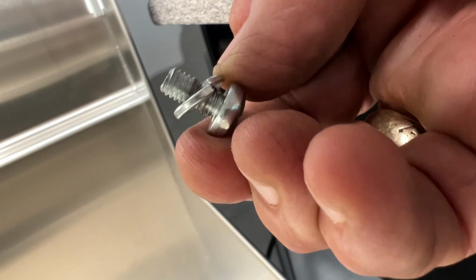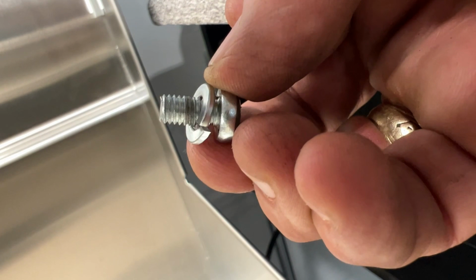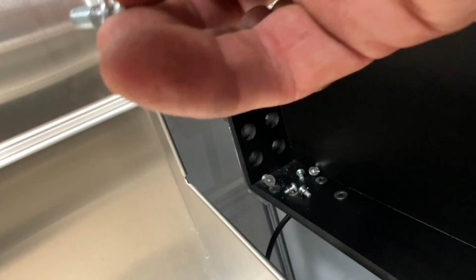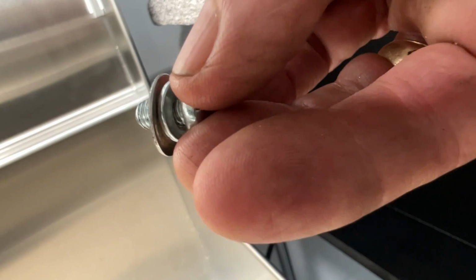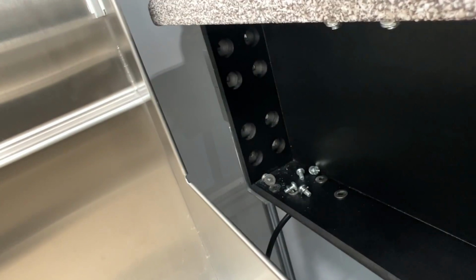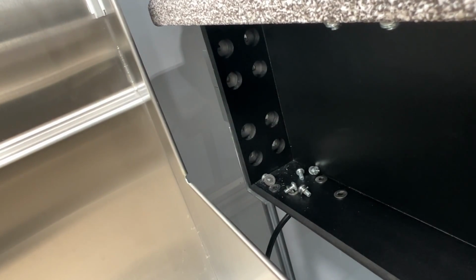Now let's gather all the screws from the bearings that we removed a little earlier. Your table may only have this particular washer and no other washer. That is normal because they were installed just a little differently. Later tables may have this additional flat washer. Whichever way yours is configured, make sure you put it back the same way as you found them. So you want to have all of your screws sitting with their washers already on them so you don't have to put the washers on every time you put a screw in.